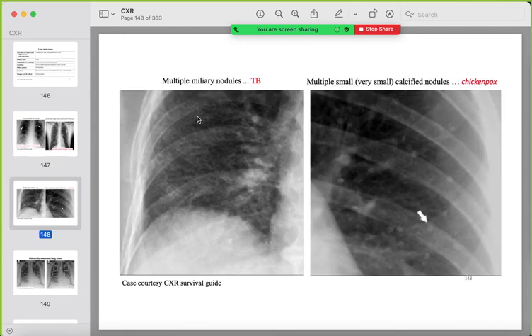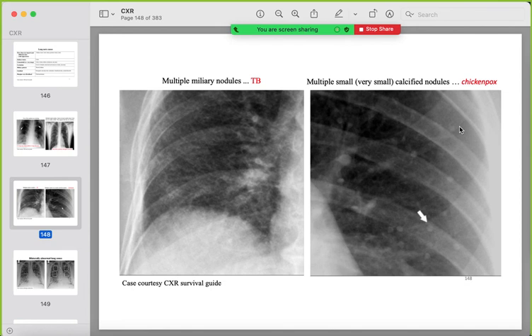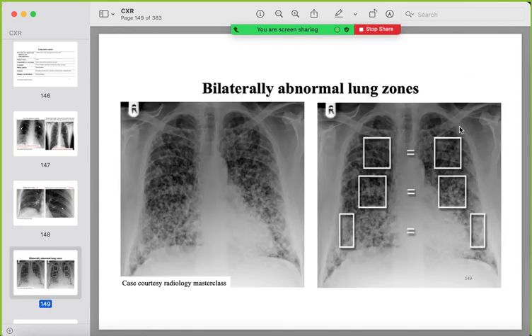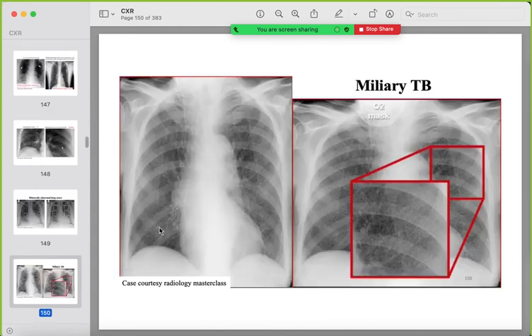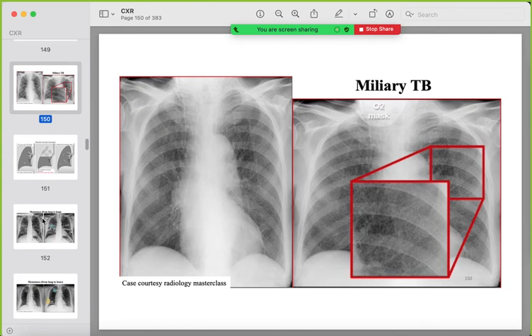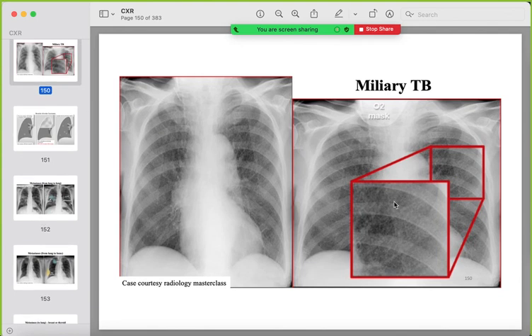Example of miliary TB: innumerable very small nodules affecting all lung zones. Compare upper, middle, and lower lung zones. Another example of miliary pattern with calcification suggests previous chickenpox. Widespread miliary distribution affecting all zones uniformly is an important pattern to recognize.